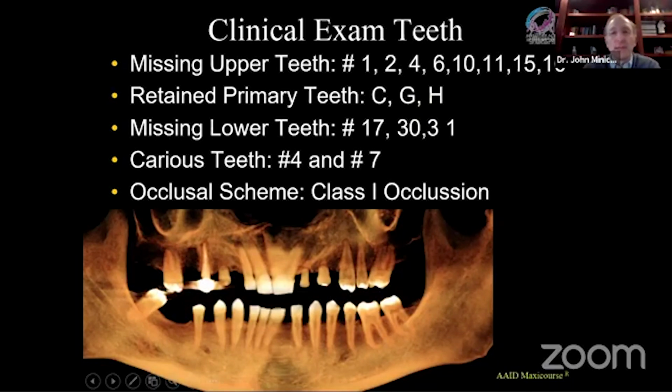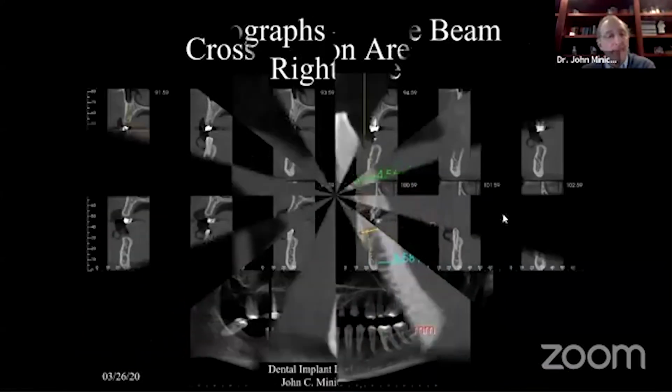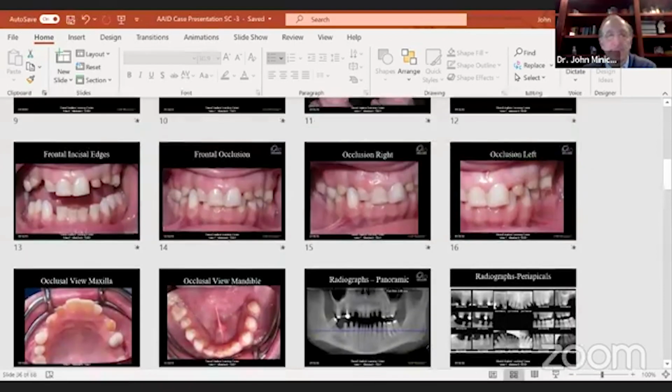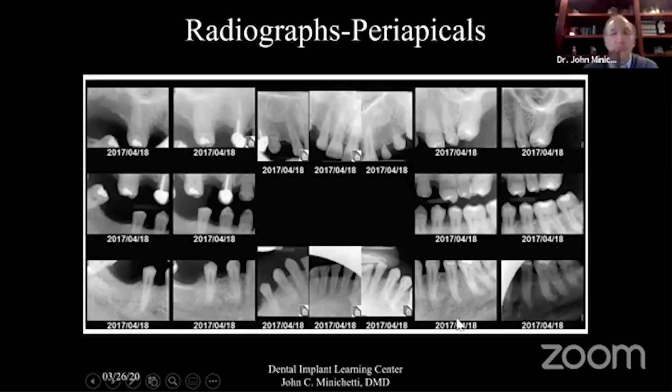It's a very good question because we're making a periodontal diagnosis. You absolutely need to make a periodontal diagnosis on this patient. Let me just see if I can go back. I'm going to go quick. Because there's really minimal attachment loss when you look at this patient, is there not? When you look at the periodontal health, good lamina dura bone here, minimal recession when you looked at the photographs also. So that's a very good question.